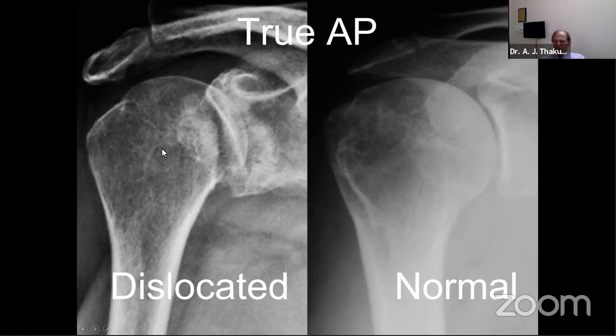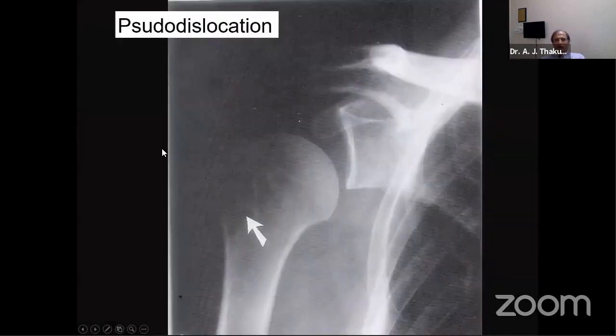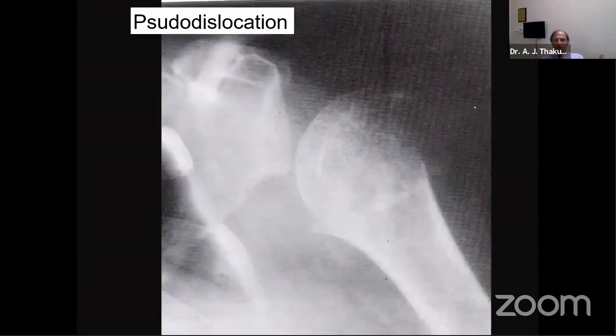This is a dislocated one. This is the anterior dislocation of the shoulder. This is pseudo dislocation because there is a fracture here, and that is called hemarthrosis. So it has caused downward displacement because of the hemarthrosis and giving us a picture of a pseudo dislocation, which can also be seen in this way. This is only indicative that there is some fluid inside which is pushing the joint down.